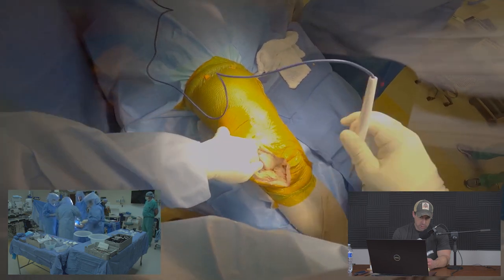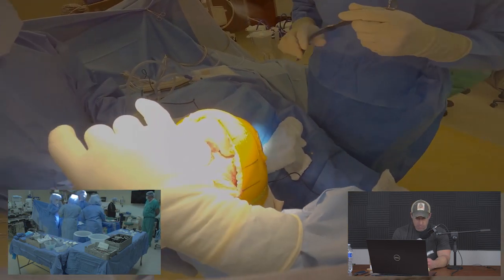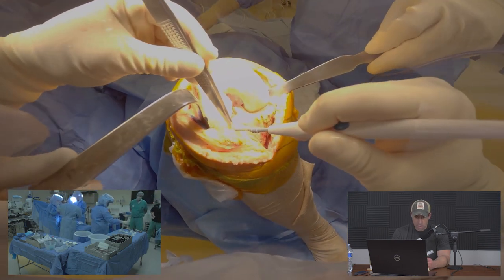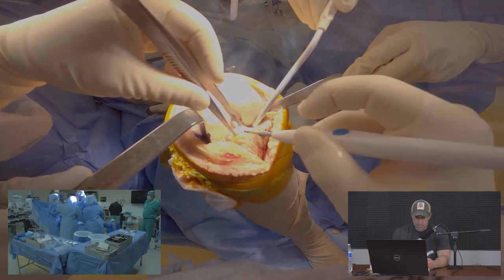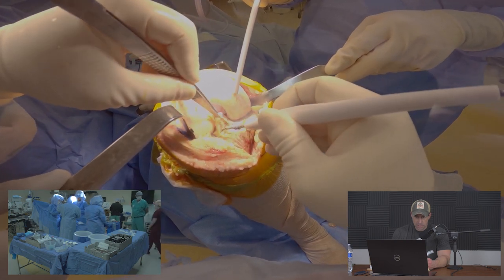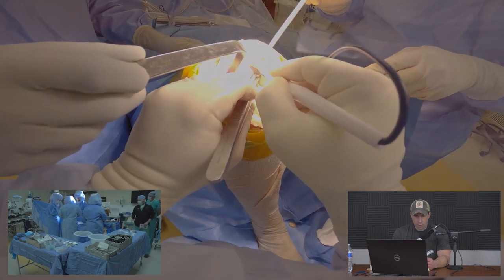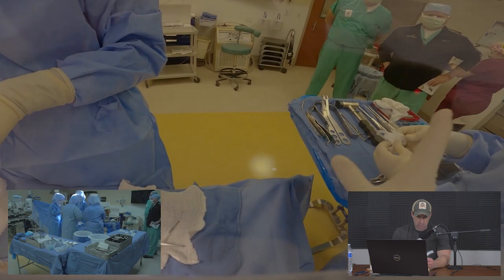Releasing soft tissue and bringing the knee back to flexion, we place retractors to expose the femur. You can see the large area of wear on the medial side. We release some fat pad and a portion of the lateral meniscus, clear anterior soft tissues, release the remaining anterior cruciate ligament, and release a portion of the posterior cruciate ligament to aid exposure — this is a posterior cruciate substituting knee.